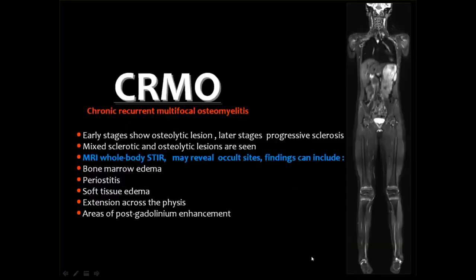And sometimes they use this technique, which is known as whole body MRI, which can help to scan the whole body for the areas of possible involvement.